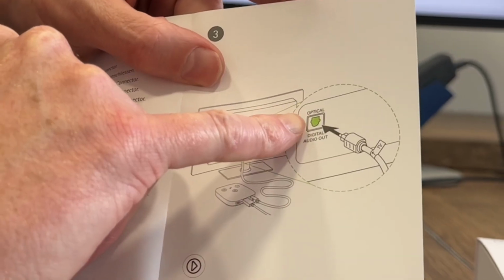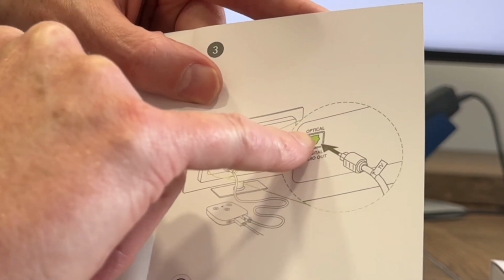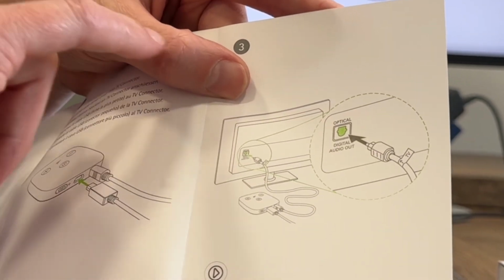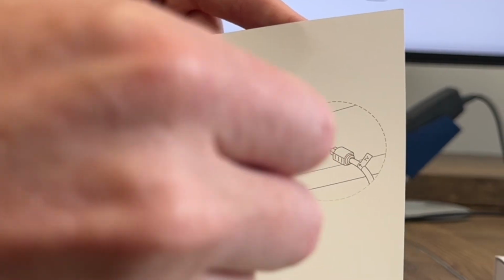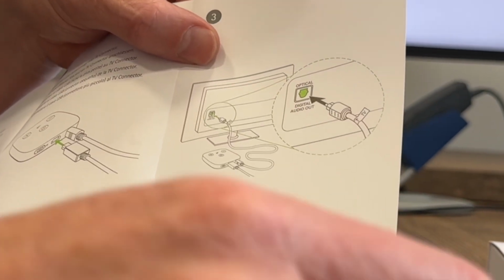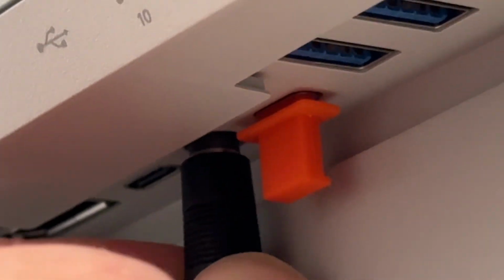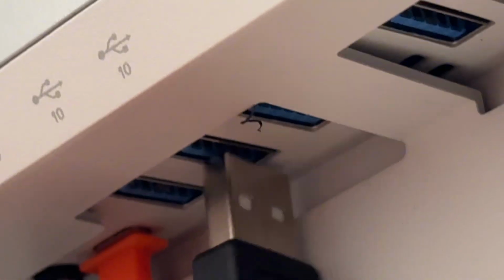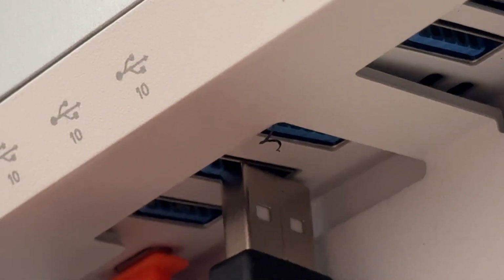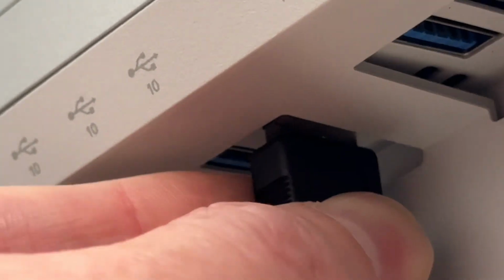It does show you quite nicely in the instructions how to do so, and it does show you what you're looking at for the optical. It's a strange kind of shape that it plugs into, and because it's using optical, there's a little flap on it, so you need to just give it a good push into it. Plugging the headphone adapter in first of all, and then plugging the USB directly into the socket here. They're always a bit difficult to get in. Finding the one, there we go.